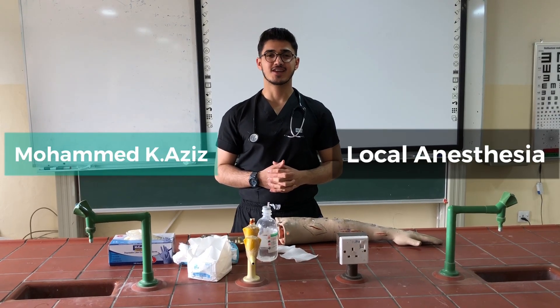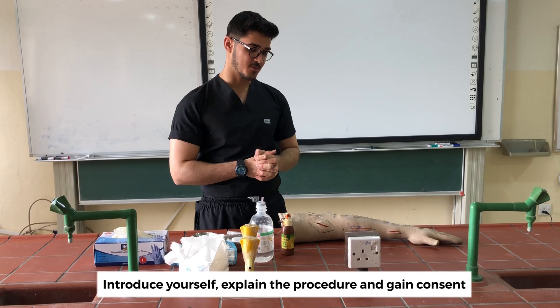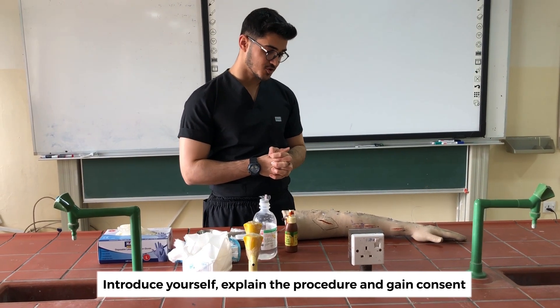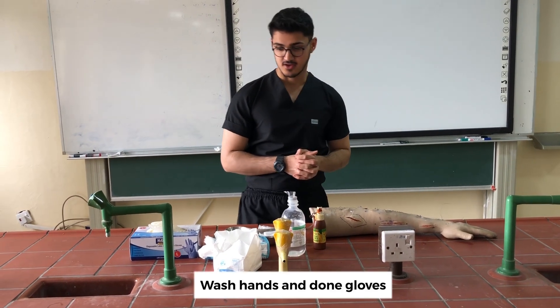CNS module: local anesthesia. My name is Muhammad, I'm a third-year medical student. I'm going to inject the local anesthetic into your wound and prepare you for suturing.